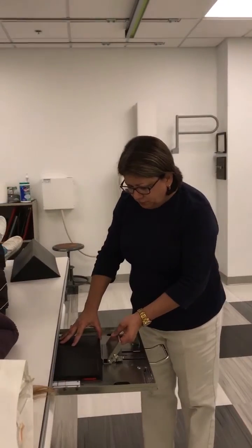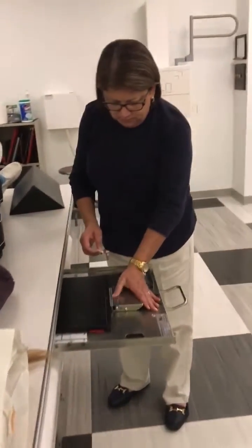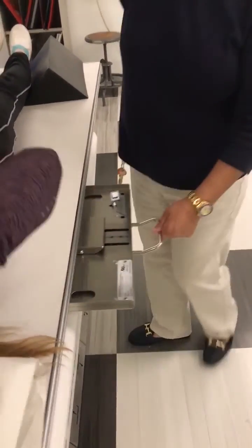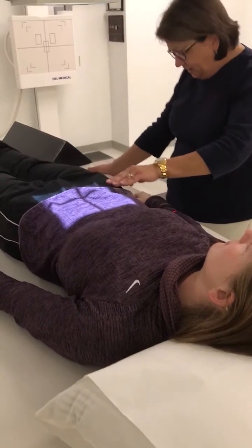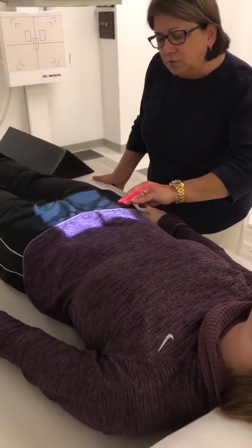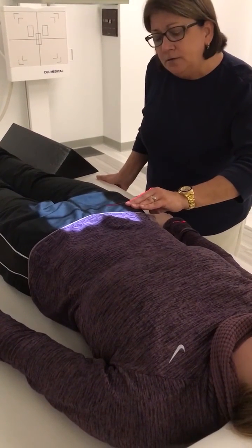So for the bladder, we're using the 10 by 12 lengthwise. I'm putting the right marker on. Arms to your side, palpating for the ASIS, and centering 2 inches below and in midline.